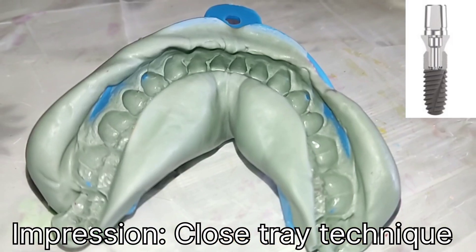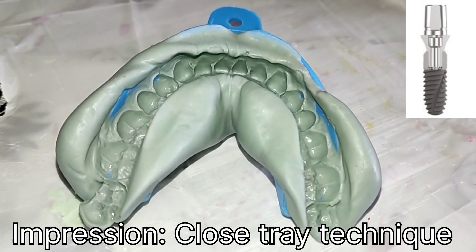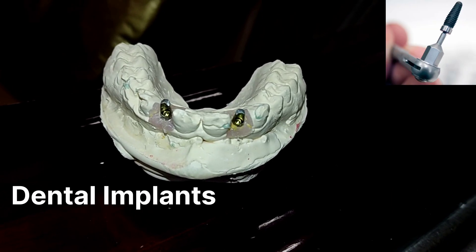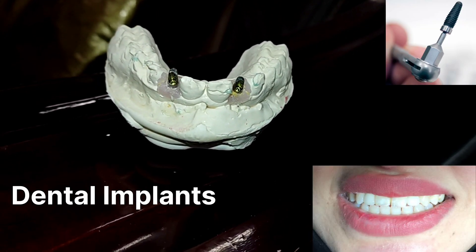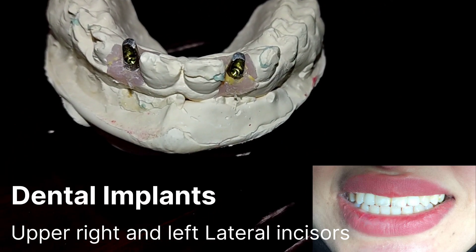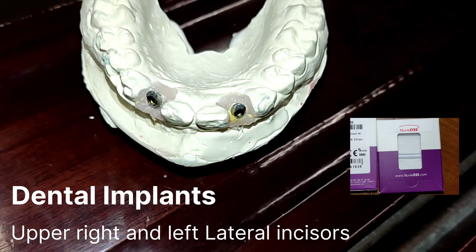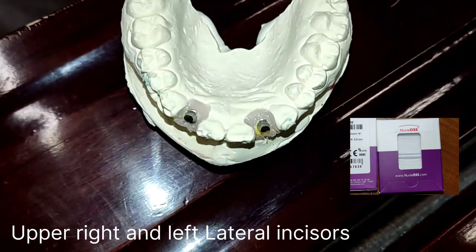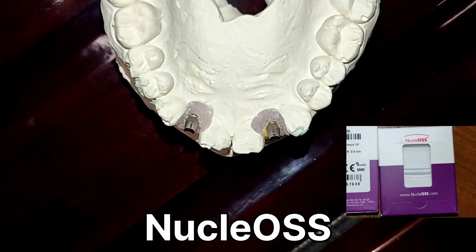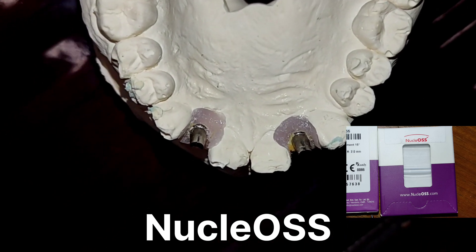The brand used was Nucle OSS. Nucle OSS abutments are shown on the master cast. As we see, the close tray impression technique is done by a specialist prosthodontist, using silicone heavy body and light body consistency with plastic disposable trays, and with analog and post after removing of gingival former or healing abutments.